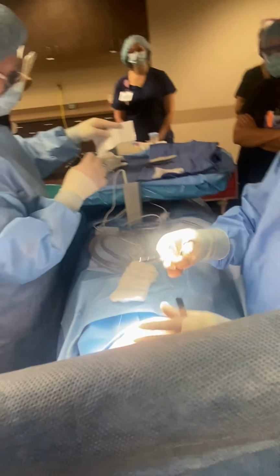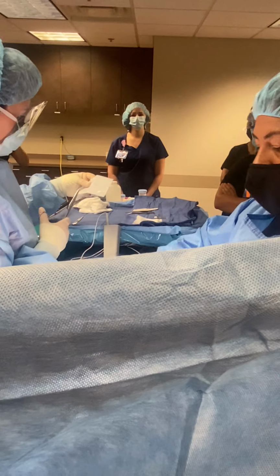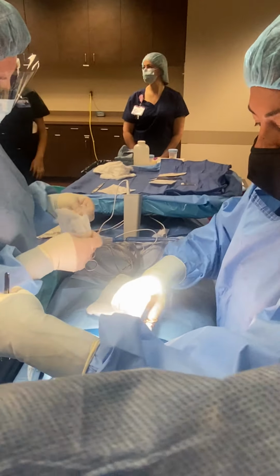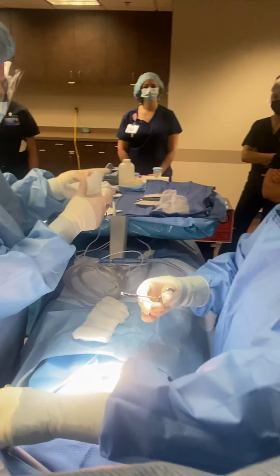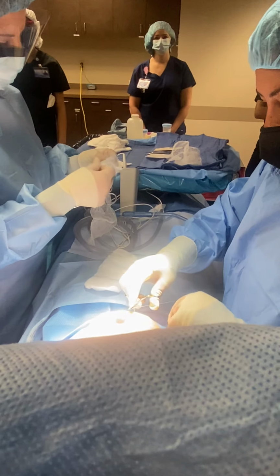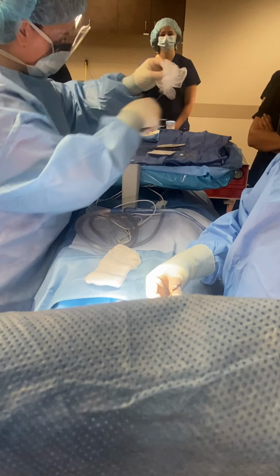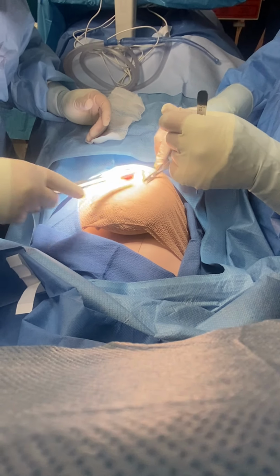Four by fours, Telfa. Do you want me to just cut a little piece of Telfa? Yes, and I'd like some fluffs as well. Just a few. You're welcome. Please and thank you. Almost there. I only have 3 4x4s. Do you want more than that? No. Okay, so you can just fluff 1 or 2. All right, you cut just above. Thank you.